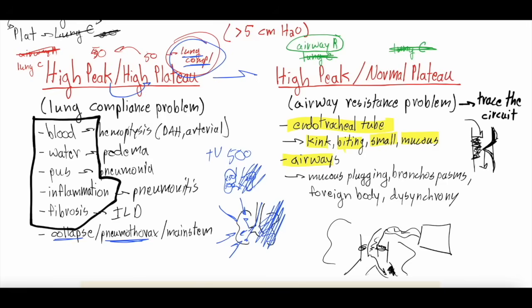And those bronchospasms is when those bronchi kind of spasm down, right? Creates smaller amount of area to flow that air through, higher airway resistance. Maybe there's a foreign body in the area. Maybe the patient has ventilator desynchrony. They're not being cooperative with that breath, and they're kind of pushing back on it. All those things can cause high airway resistance. So again, high peak pressure.